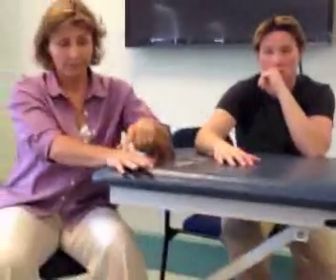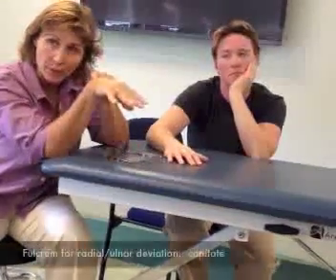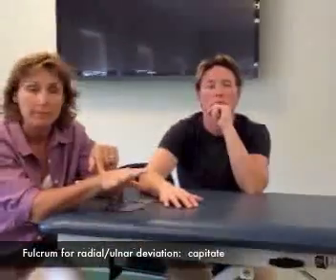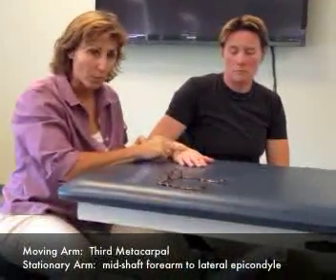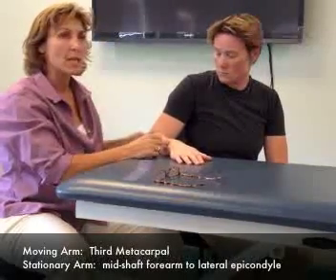Now let's find your capitate, because the next motions we're going to do are radial and ulnar deviation. Find your third metacarpal and follow it down until you feel a little depression. If you flex your wrist, you'll feel something kind of pop up — that's your capitate. The capitate is your fulcrum for radial deviation and ulnar deviation. Your moving arm is the third metacarpal, and your stationary arm is the mid-shaft of the forearm up to the lateral epicondyle.